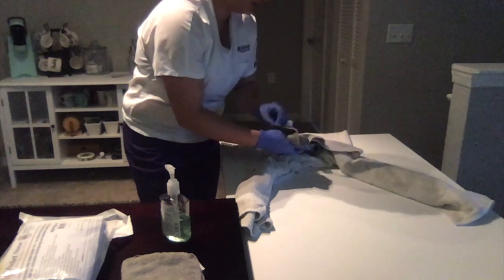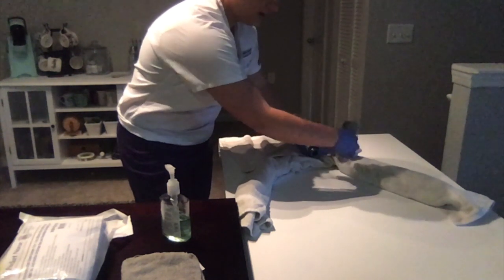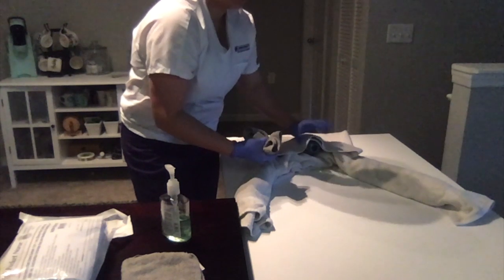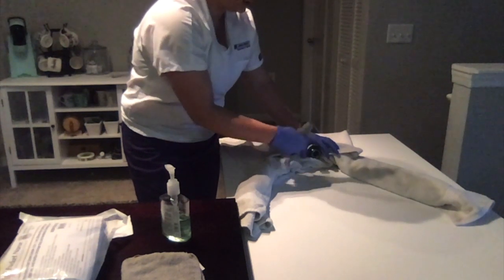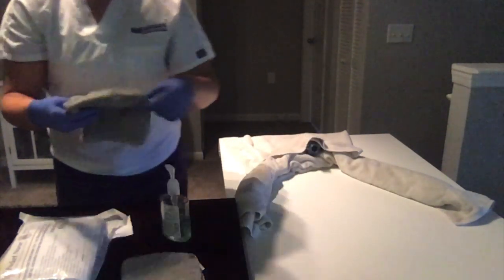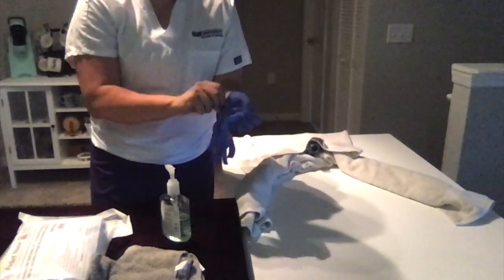I'm going to change it. And then I'm going to go the other way, around and down. And then I'm going to change it, and then I'm going to go right down the center from front to back. So each wipe is going to be from front to back. Once I have done that, I can remove my gloves.